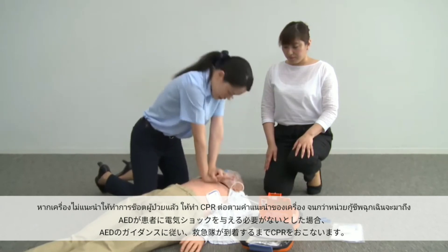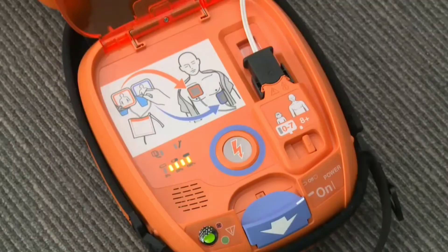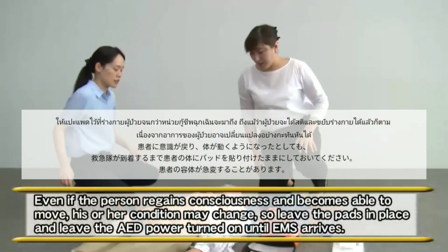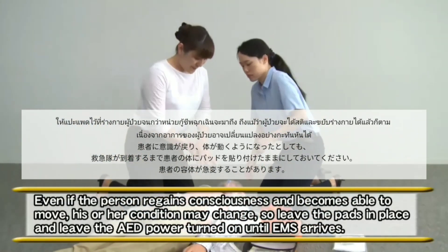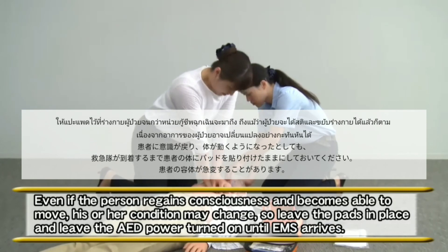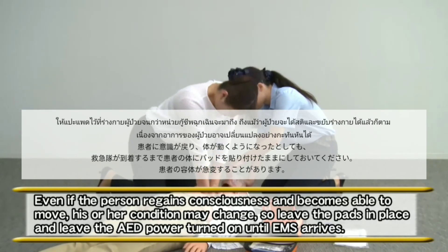Continue CPR according to the voice instruction until EMS arrives. Even if the person regains consciousness and becomes able to move, his or her condition may change. So leave the pads in place and leave the AED power turned on until EMS arrives.